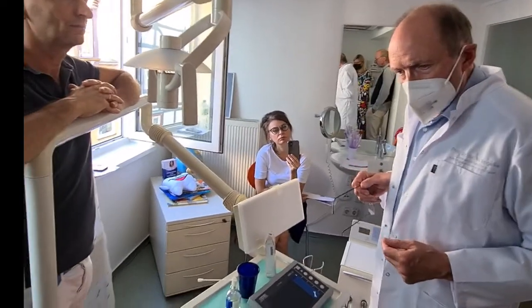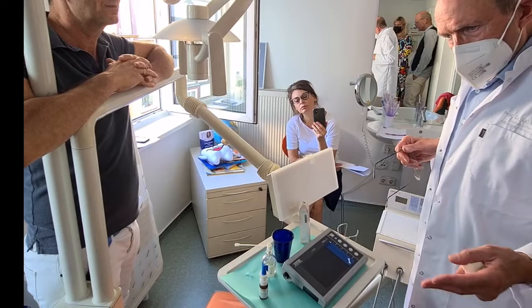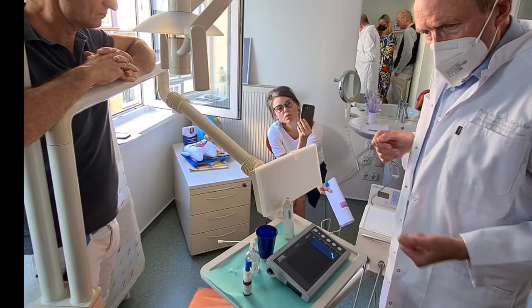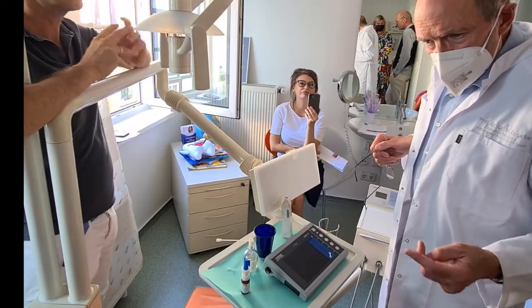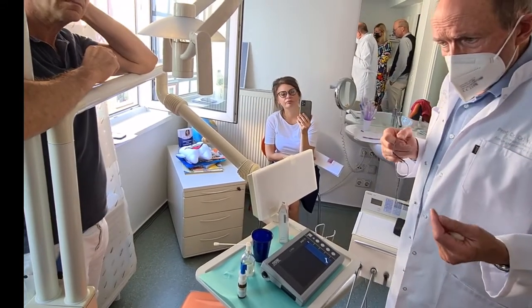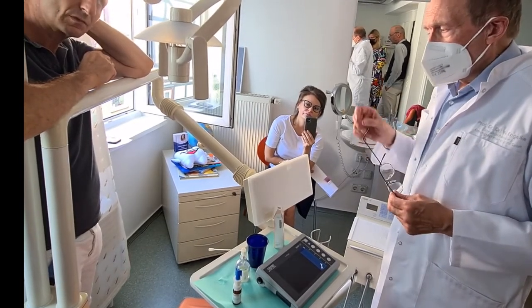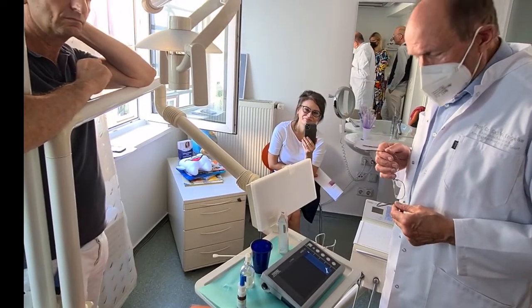So thank you very much. Really, I think that the protrusion, the maximum protrusion, helps. Yeah, I feel that it helps when it's in front. Yeah. This is what the endoscopy gives as information. Right, okay. So you may change the degree of protrusion, and you also may use, instead of the elastics, rigid connections.